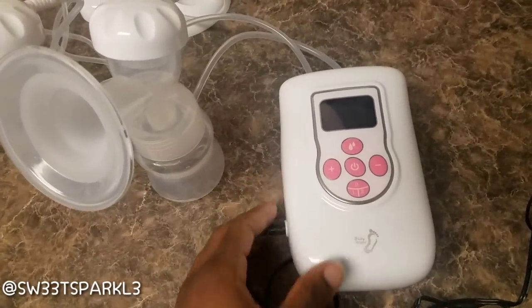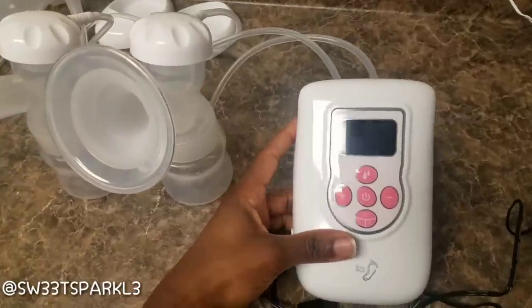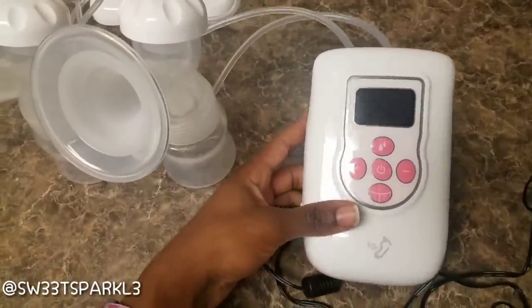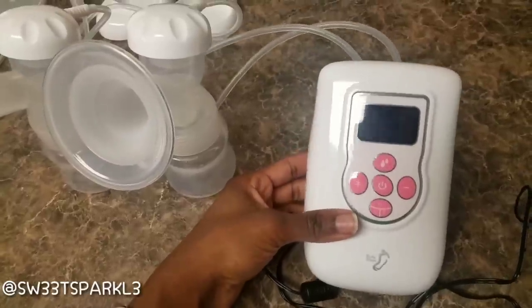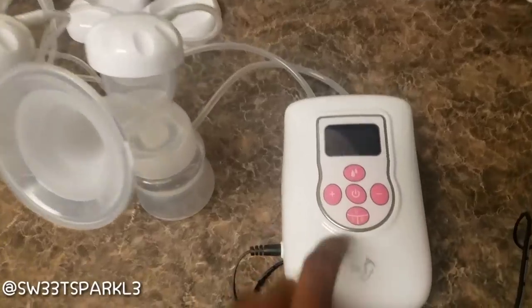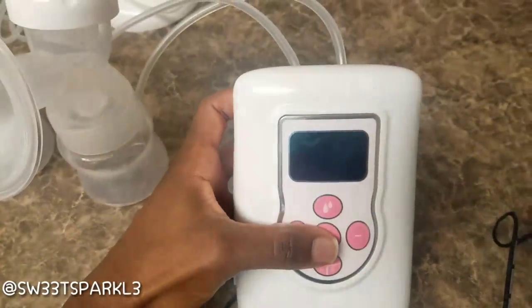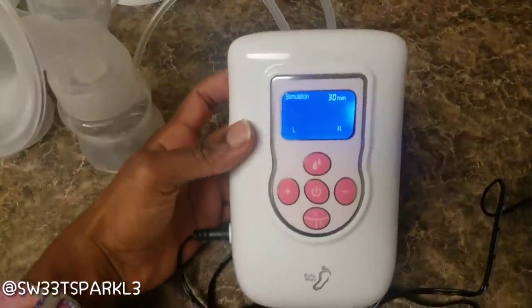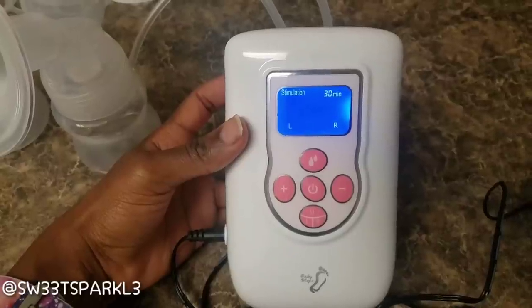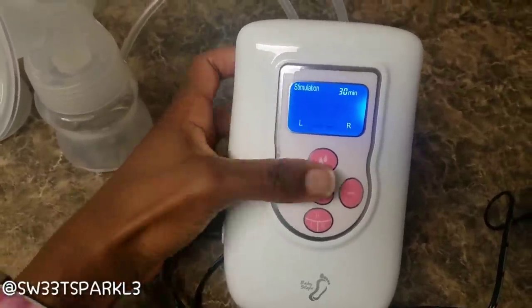I have the pump plugged into the outlet right now. I'm just going to turn it on to let you hear the pump and see how it operates. One thing I really like about this pump is it's super super quiet — I have never heard a pump this quiet before. I do own one already, but it's definitely not as quiet as this one. I'm going to go ahead and hit the power button in the middle.